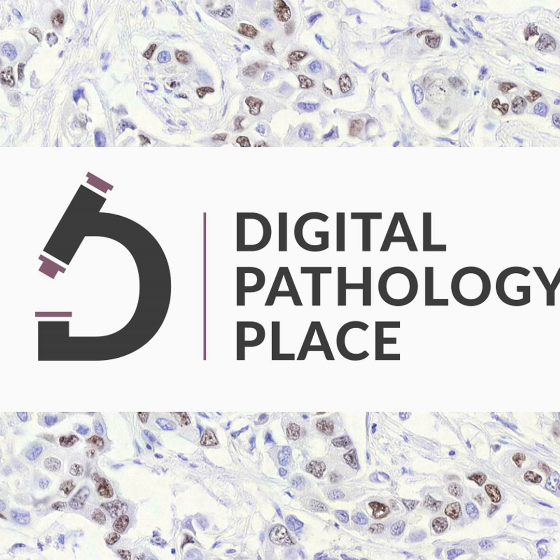Okay. They defined the main goal very clearly. It needed to be a super sensitive screening tool, aiming for nearly 100% sensitivity. The big value add wasn't necessarily finding cases humans would miss, but achieving a significant, measurable gain in time to diagnosis. And integration, that was also a requirement right from the start. The results had to show up seamlessly right within their existing image management system. No separate windows or logins.